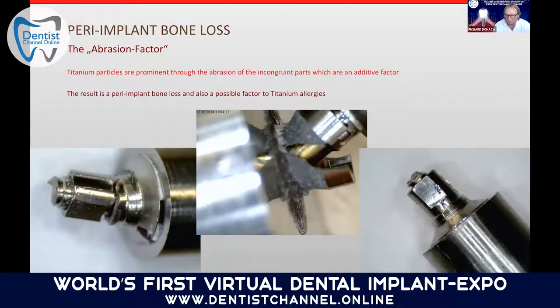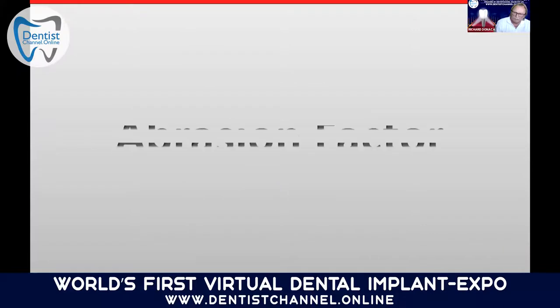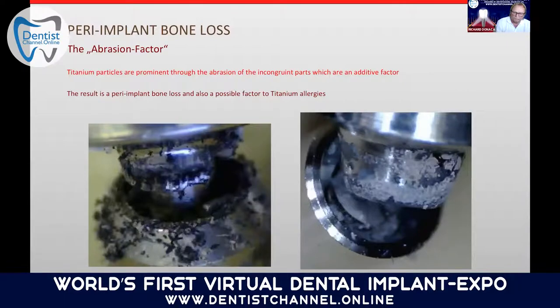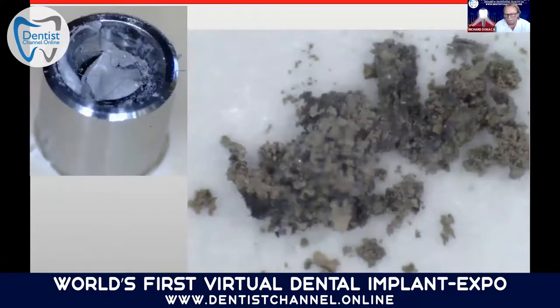They do go into the bloodstream and the soft tissue area. Through tests, you can see that besides breakages, the abrasion factor also causes titanium particles to develop through the abrasion of the two parts, the abutment and the implant. And you can see here that after lifetime use, a lot of titanium particles have developed. This was after 5 million cycles of an implant connection. This is quite a bit of titanium that has developed as particles through abrasion. These, of course, go into the bloodstream, are swallowed by the patient, or go into the outlying soft tissue areas.